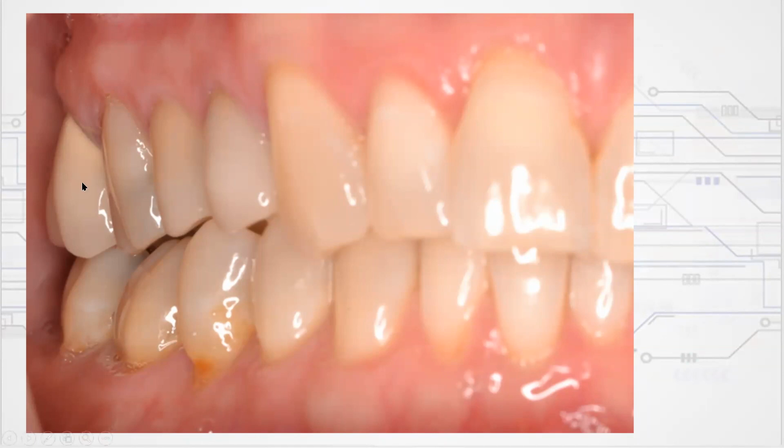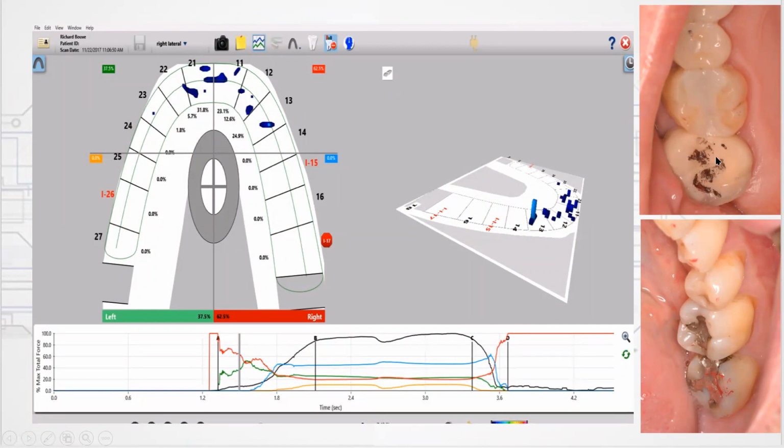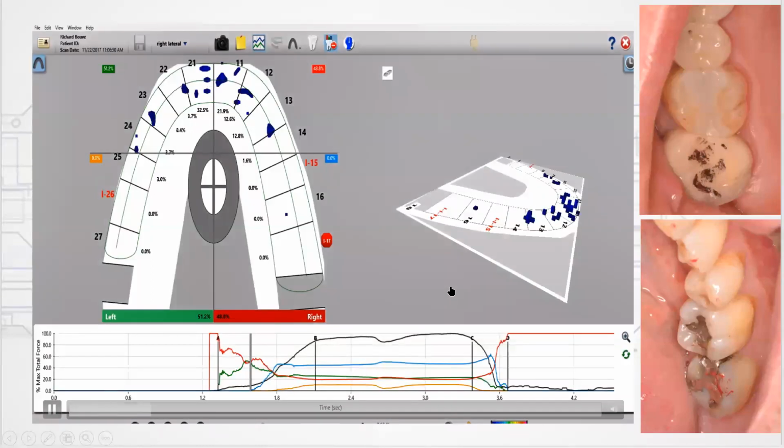And he has an implant here on tooth number, this would be the 1.7. This would be the 1.5. He has an implant, and I think one on the other side. And the problem one is on the 1.7. And you can see that here. There are 2 other implants, the 2.6 and the 1.5, and they don't have a warning, right? And this was the articulating paper marking. So there's obviously a lot of contact on the 1.7 implant. But what does it look like with the T-scan?